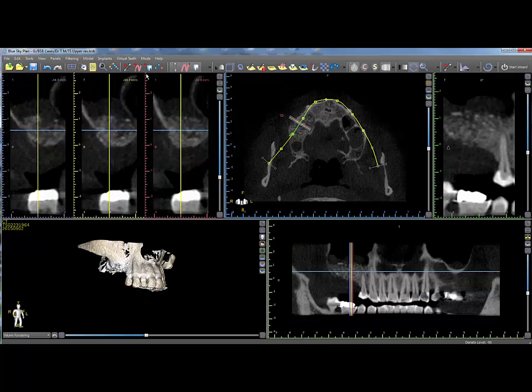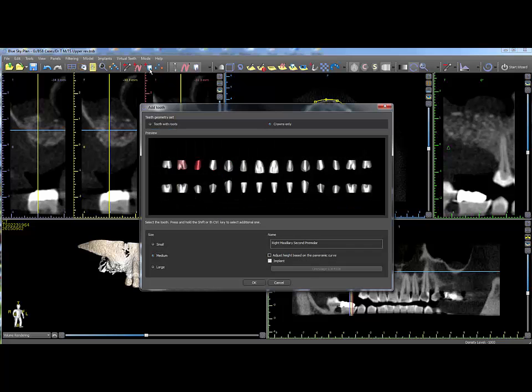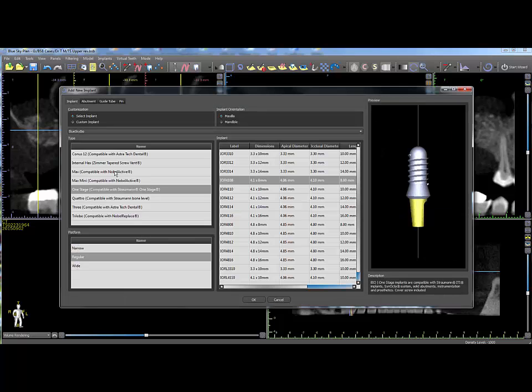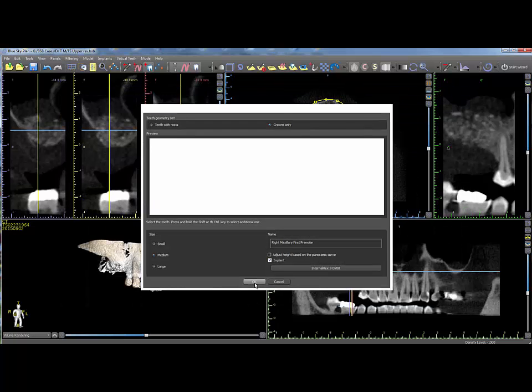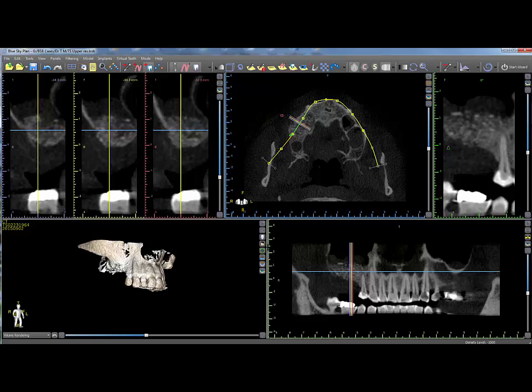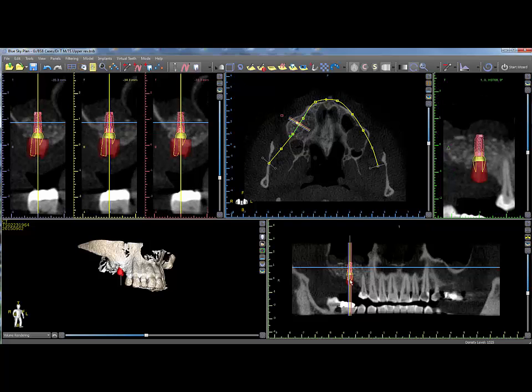A virtual tooth and an implant may be placed at the same time. In the Add Tooth window, select a tooth, then click on the Implant checkbox at the lower right. Select the implant and click OK. Click OK in the Add Tooth window and click on the image in order to place the tooth and implant simultaneously.